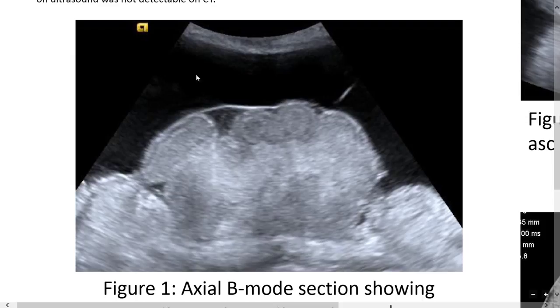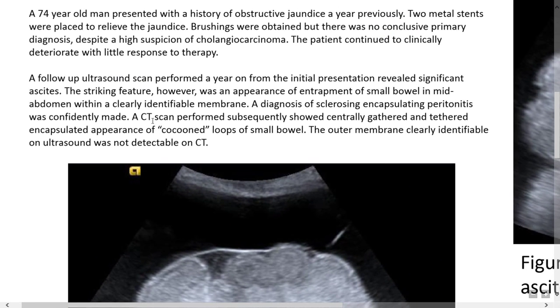Here is Figure 1: a B-mode axial image demonstrating ascites and then this capsule with fluid and small bowel loops within it. A CT scan was subsequently performed, which showed essentially a gathered and tethered encapsulated appearance of cocooned loops of small bowel.